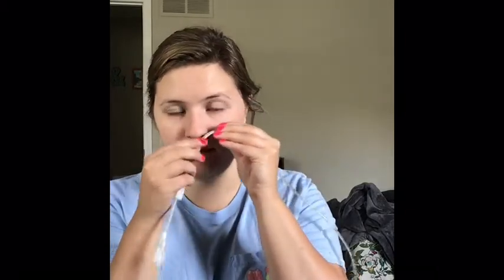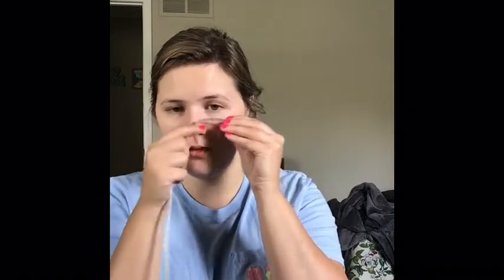Okay, and then what I would do is have my patient take a deep breath and hold their breath, and then I would just pull it out. So I'm pulling it out, pulling it out. Okay, so it's out, and I'm just going to wrap it up in this towel, and then I would dispose of it.